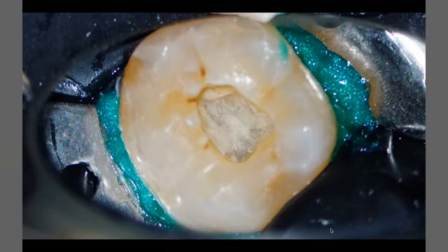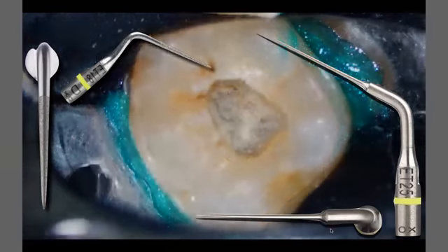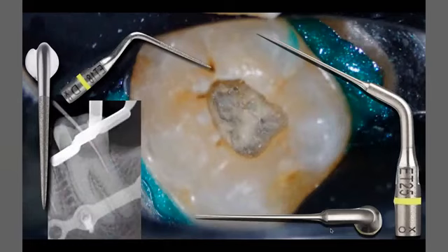As you can see here, I have calcified tissues. The bright dentine is the calcification. I have to remove all the calcification with ultrasonic tips. With diamond tips, I will start to remove the calcification. Then I will shift to the stainless steel, non-coated ultrasonic tips, just to break up the calcification more. And now you can see in this X-ray that I can see more colors. I can see dark dentine. I can see some points on the mesial side and also on the distal side.